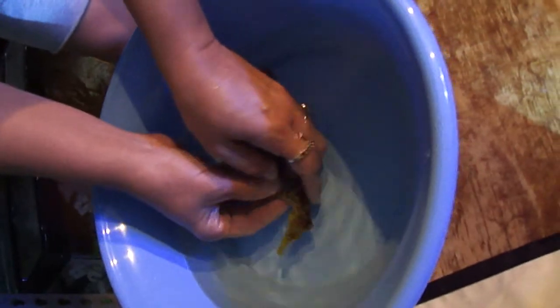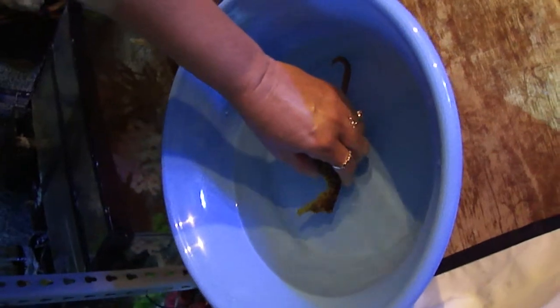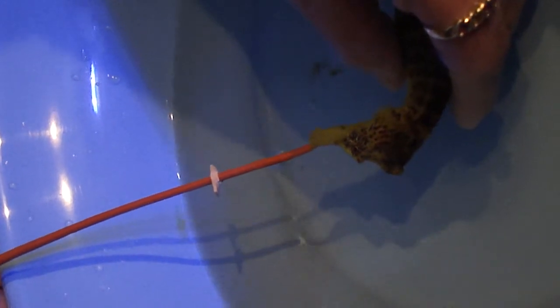Okay, she's getting better. This is the tricky part — trying to do this by yourself. I've got the tube and the catheter, and you have to make sure the head's tipped back far enough. The secret is to get the tip of the catheter in her mouth. I was told there are no air bubbles, and I've also read that when she's breathing is when you want to do this. There's a small opening here — you'll see the catheter go in.